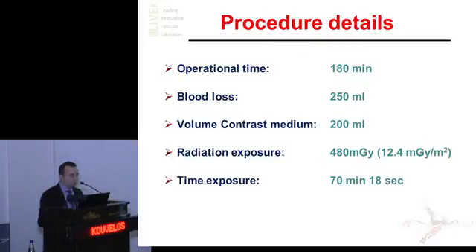So the operation took around 3 hours. The blood loss was 250. The contrast media used was 200 milliliters. The exposure was nearly 500 milliGray, and the exposure time was 70 minutes of radiation.